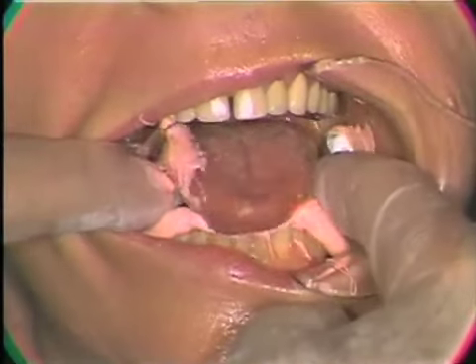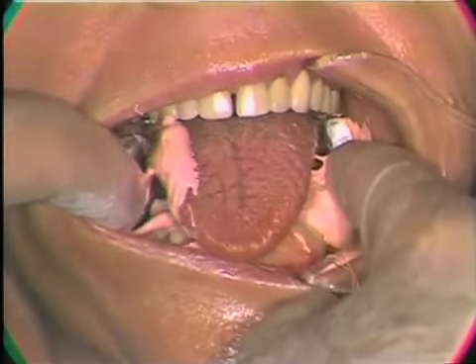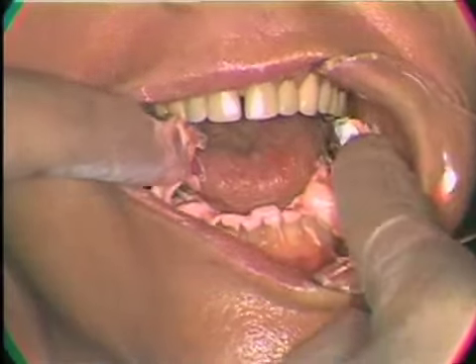Patient, stick your tongue way out. Take your tongue back now. Toes together. Bring your teeth together. Right together. Lips together. And we allow that to set up. As we said, we like the material to set up as fast as we can. Probably takes 1 to 2 minutes for that to set, get the initial set.